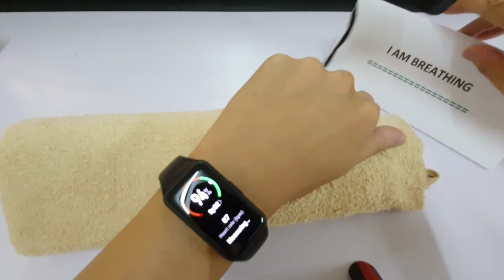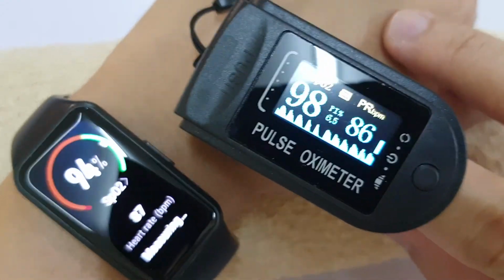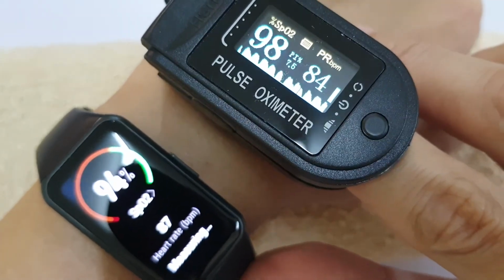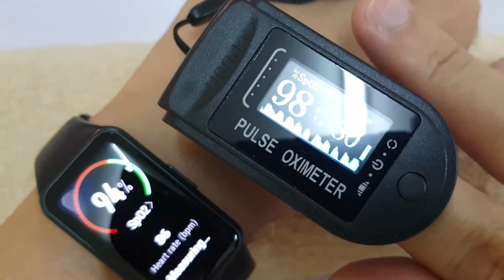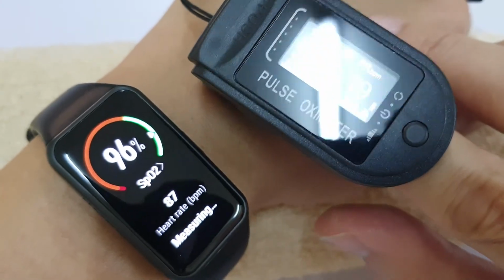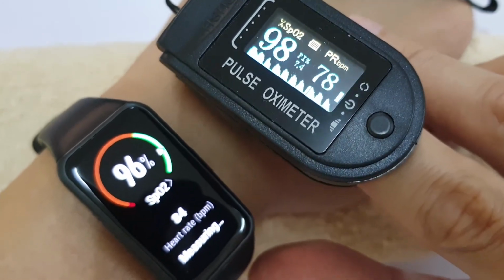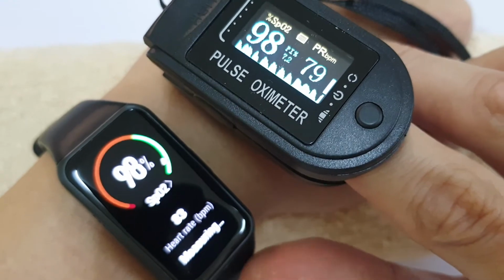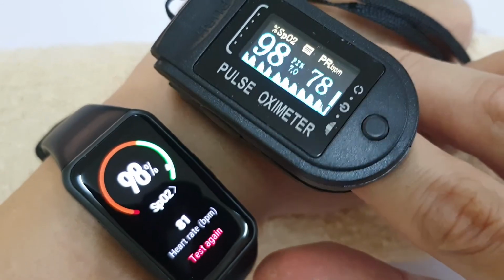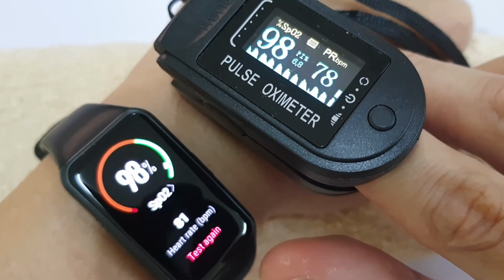Okay, so you actually see, let me just show you this if I can zoom this in, that between the two, the fitness band actually works if you wear it tightly and correctly. The pulse oximeter most of the time is correct because all you do is put a finger inside, and that is the risk of using a fitness band to measure your SpO2 levels. This is fine for exercise purposes, but if you want to use it for COVID measurement, unless you wear it properly, it may not give you an accurate result.